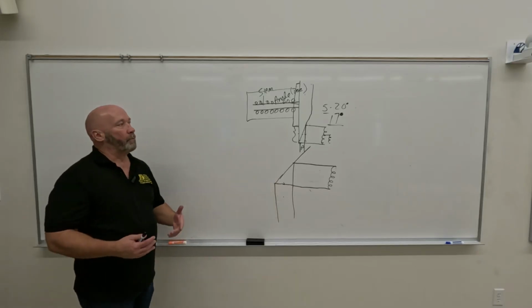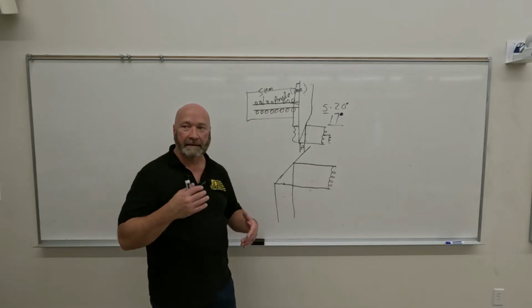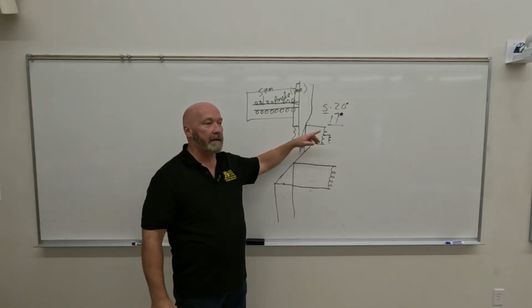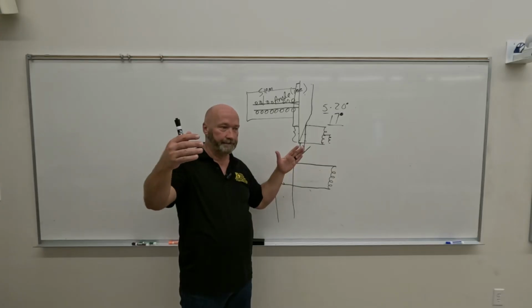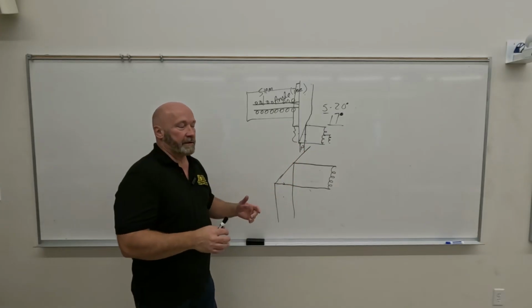Okay, so what controls our sharpness or recorded detail inherent in our X-ray tube is two things. It's not just the filament size, it's the angulation of the anode. The steeper the angulation of the anode, the higher the sharpness or recorded detail, the better sharpness we're going to have.